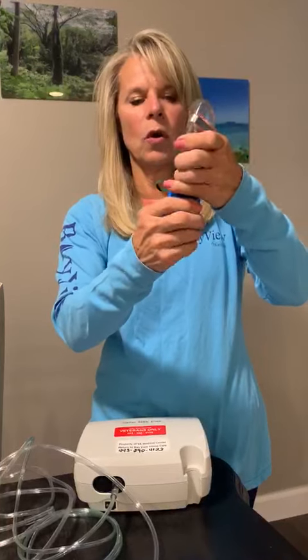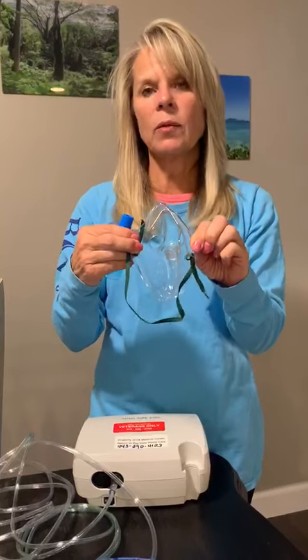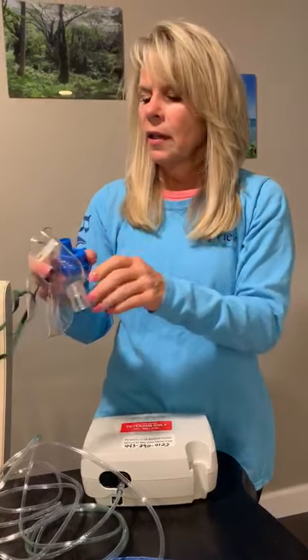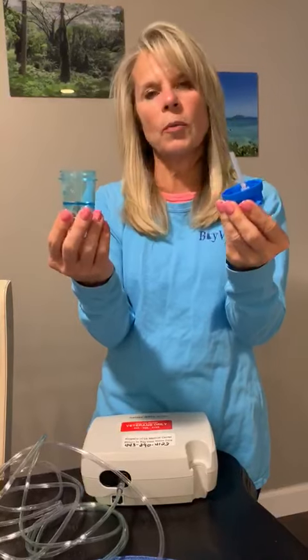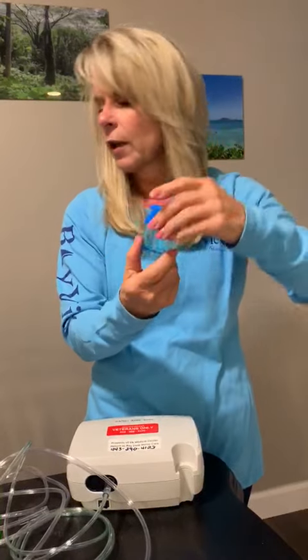At the end of the day, remove the aerosol face mask. Wipe the inside with a lightly soaked paper towel and then wipe it down. Take the nebulizer cup and lid, unscrew the lid, wash it in warm soapy water, rinse it, and let it air dry. In the morning, put it all back together and you're ready for your treatment.